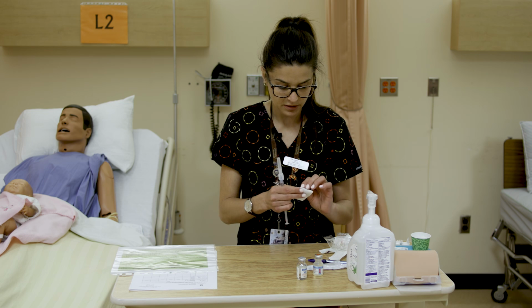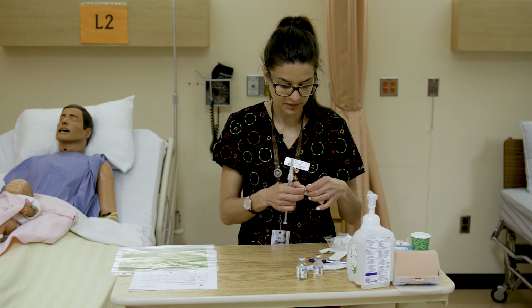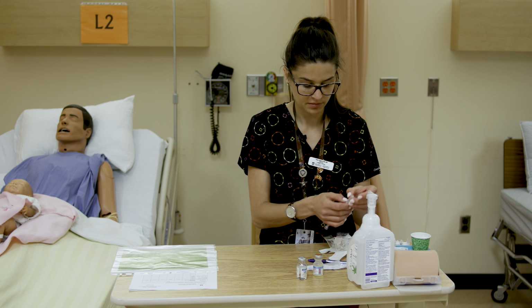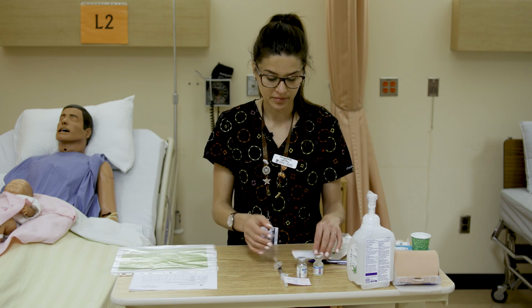So just like with the others, we can carefully attach it to our syringe in a way that doesn't impede reading the markings, doesn't cover the markings. We'll just put it on the cap, and we'll put it aside for now, and I'll just review why we selected that needle.